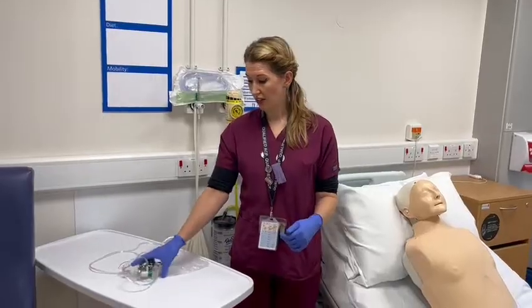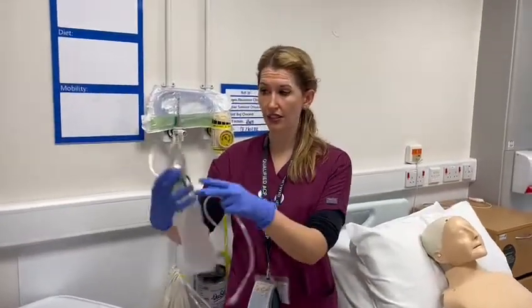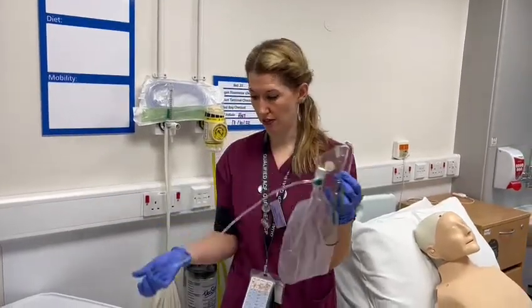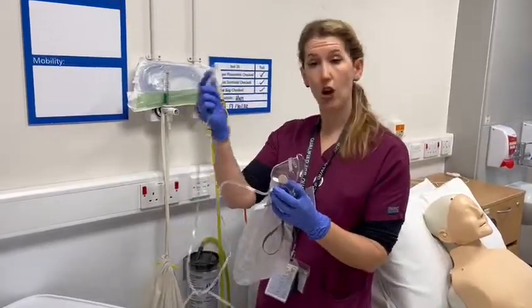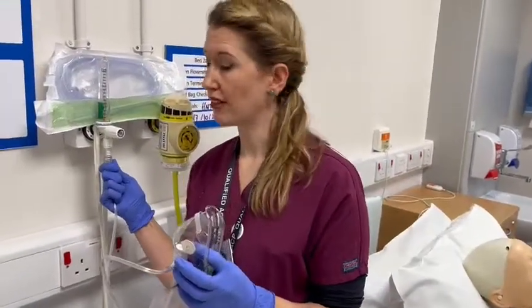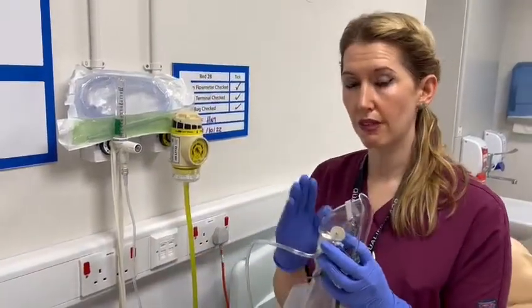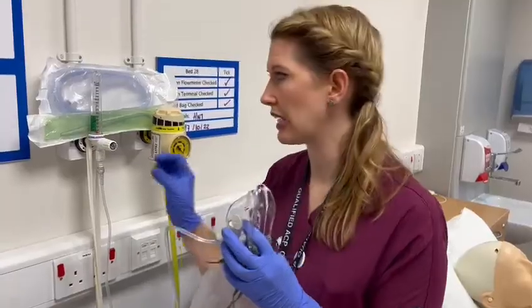Our options are to get this delivery device — you'll see that it's a mask with a reservoir bag with oxygen. So you'd open up the packet, get the end of your oxygen, go to your oxygen port, and again you'd need to make sure that you do apply this well because you're going to be putting a lot of oxygen through this. The minimum this device can have is 10 litres, but we'd always recommend just starting off at 15 litres.